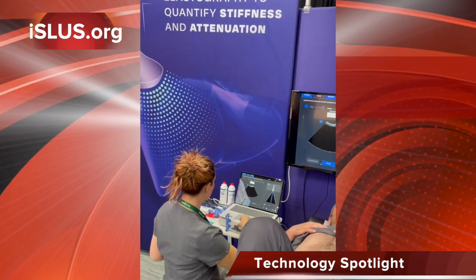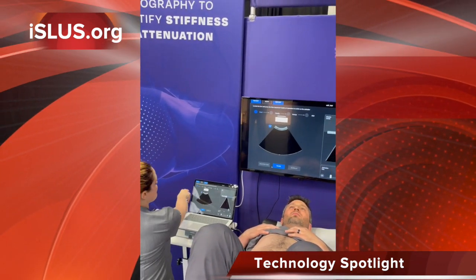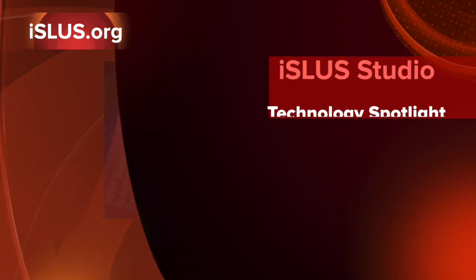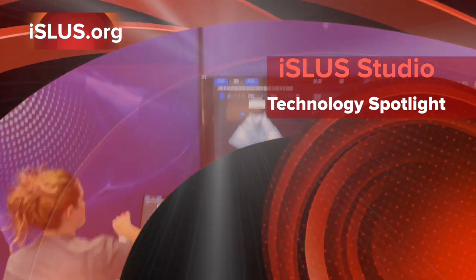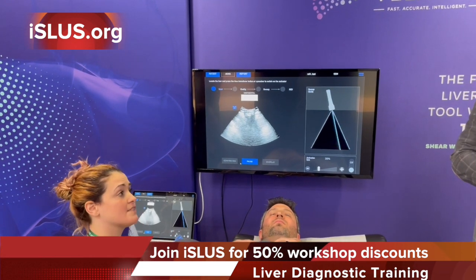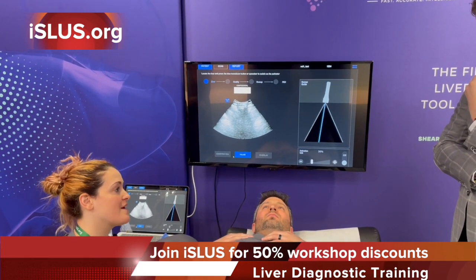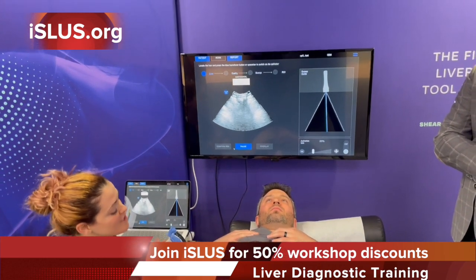Great. Hi, my name's Emily. I am going to do a quick liver scan here on my volunteer. So when you say liver scan, what technology are you using, and what are you acquiring? So we work with what we call S-waves, so it makes waves from the bottom up. There's a pad underneath my volunteer here that's going to create waves through the liver that'll be read by my ultrasound.